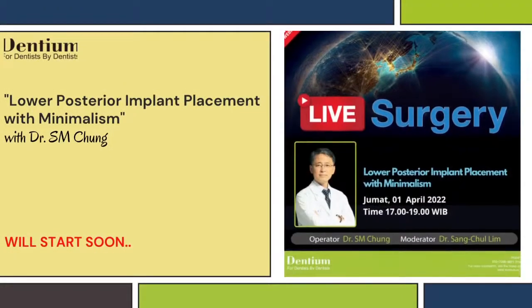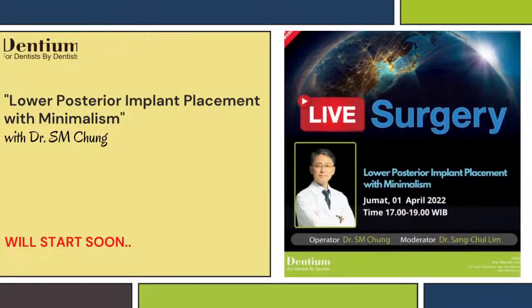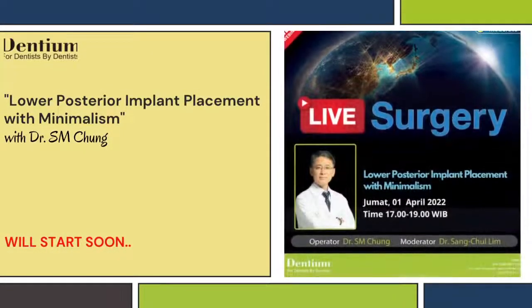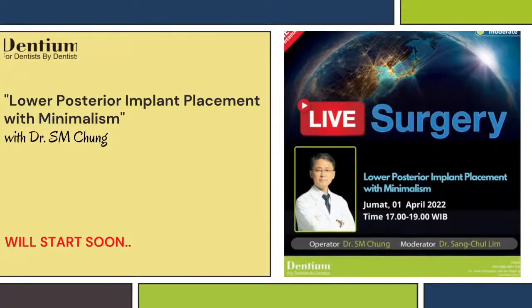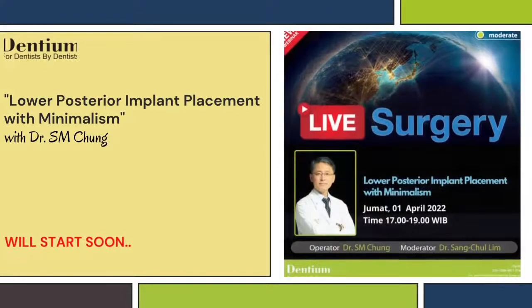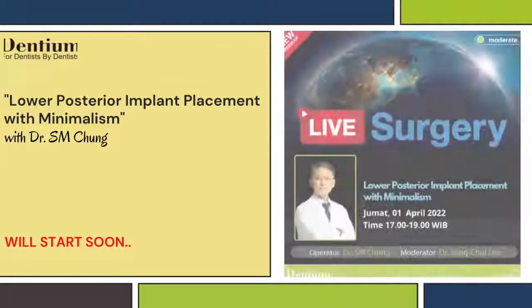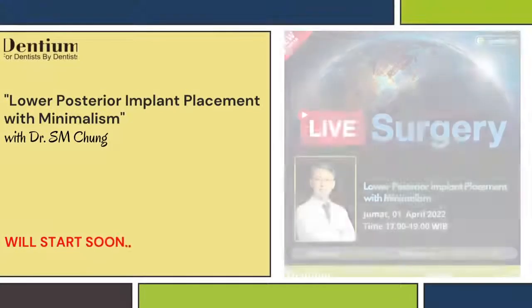Let's see the provisional restoration here. After enough temporization period, we can move to finalization, right? When we make a final restoration, as I already mentioned before, scan and comfort cap connection makes it very easy to make a final restoration, especially a monolithic one. Nowadays, as you know, intraoral scan and monolithic procedures are very prevalent, right? So here is the final restoration inserted, with the panoramic view, intraoral scan, and intraoral photos.